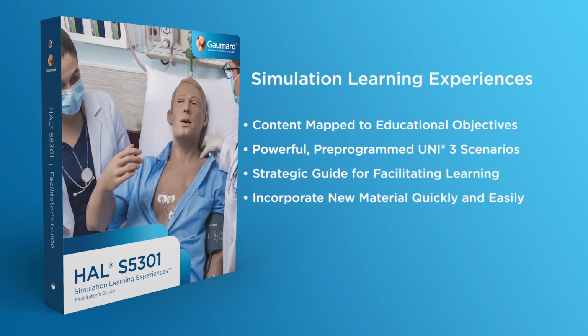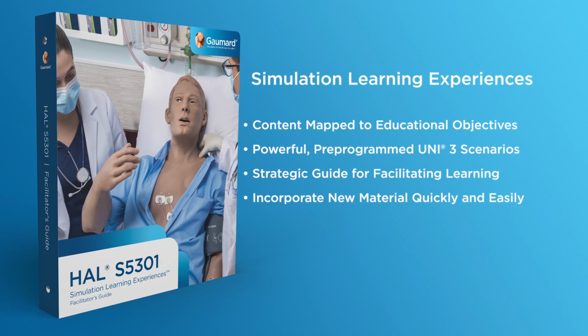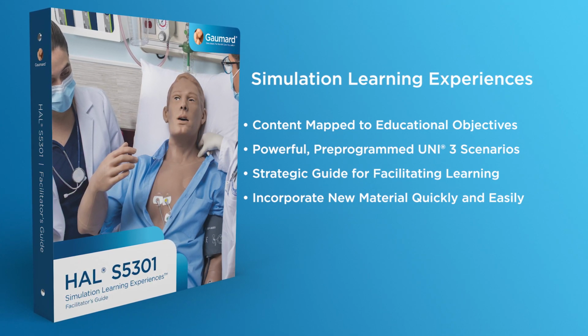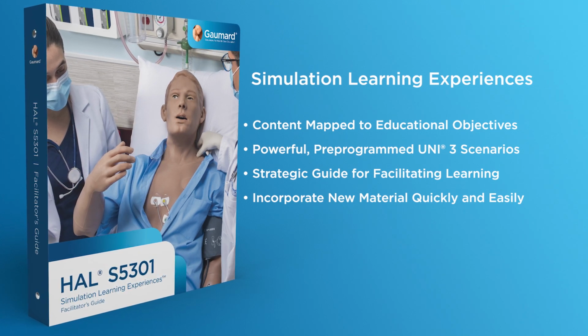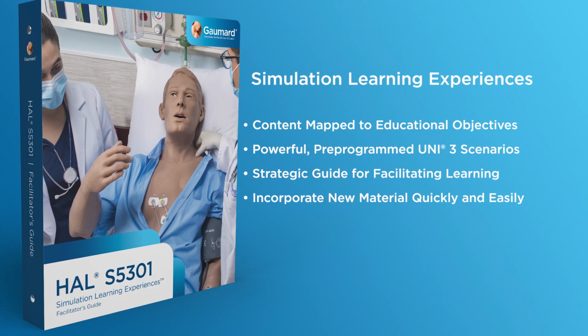The scenario package includes scenario content mapped to your educational objectives, pre-programmed UNI 3 scenarios, and a facilitator's guide designed to help you plan, set up, and facilitate the SLE. These resources are designed so you can incorporate the new material quickly and easily into your education program.